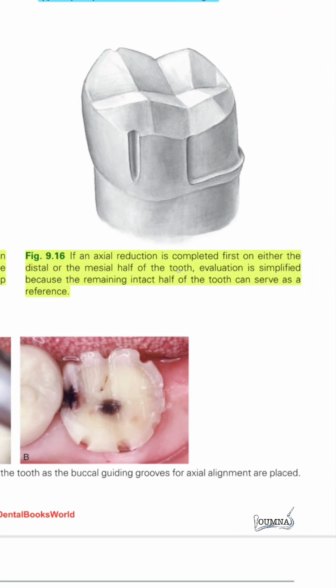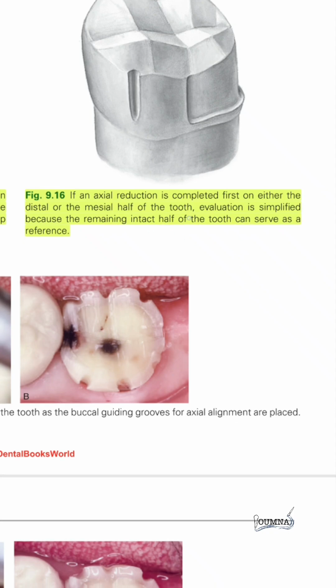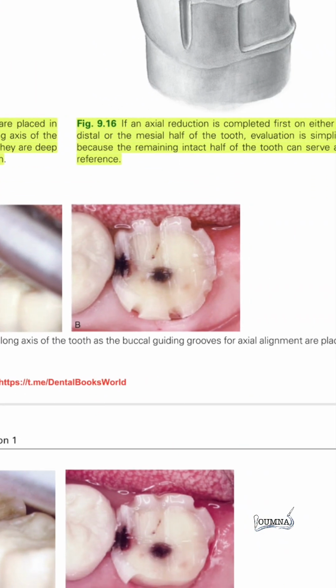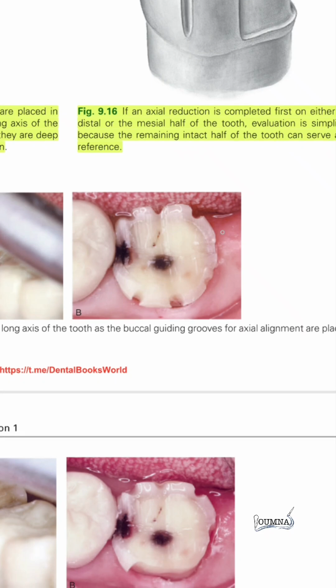And we do the reduction on half of the tooth to evaluate the thickness when we have half of the tooth that is still intact. These are the grooves on the sides. We put them on 3 sides, and we maintain the proximal side where we have a contact with another tooth, and we will see now how we will do the preparation for this area.